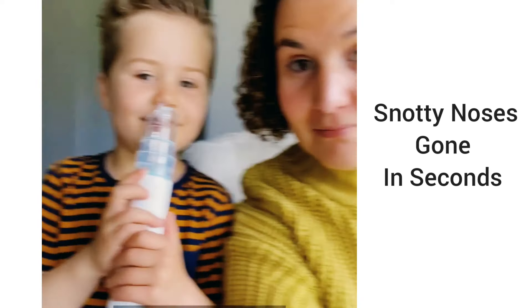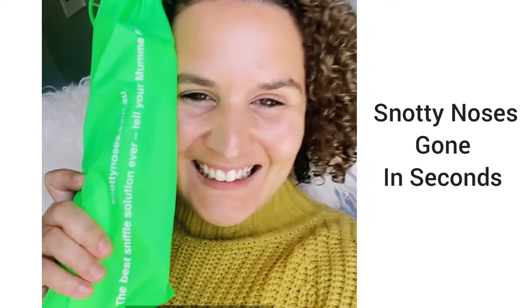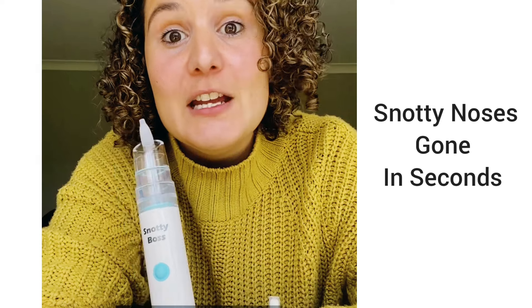It can be used from birth until your child is old enough to blow their own nose, so you know you're getting great value. And it is registered with the Australian TGA. Head to the Snotty Noses website to get yours today.